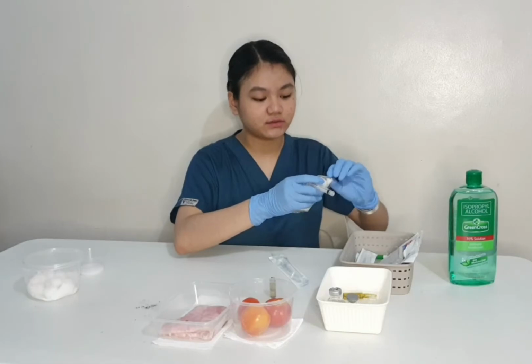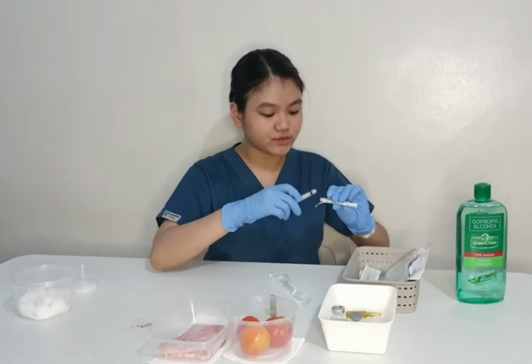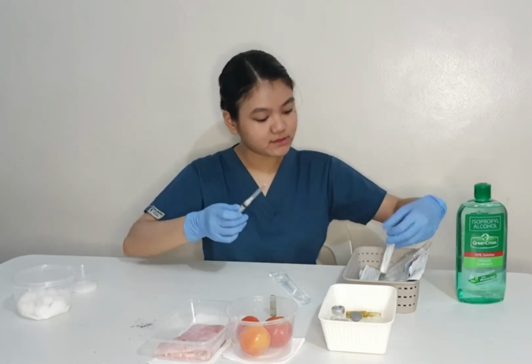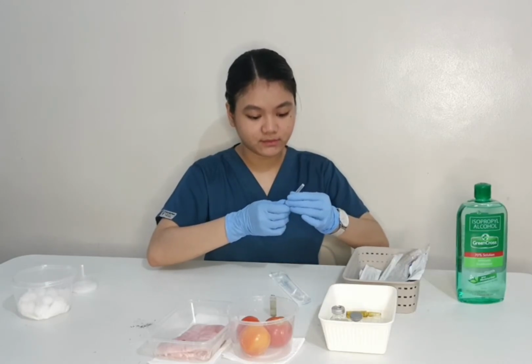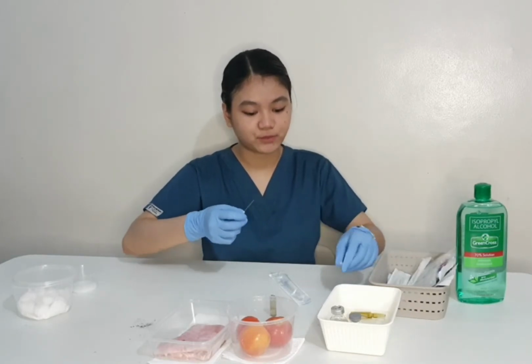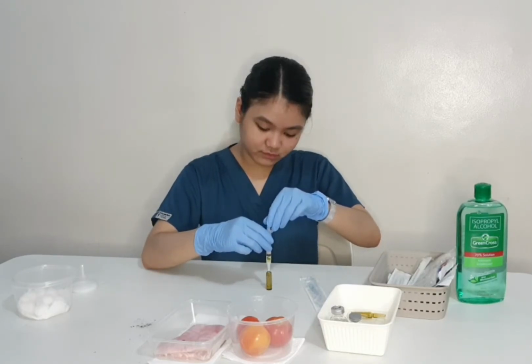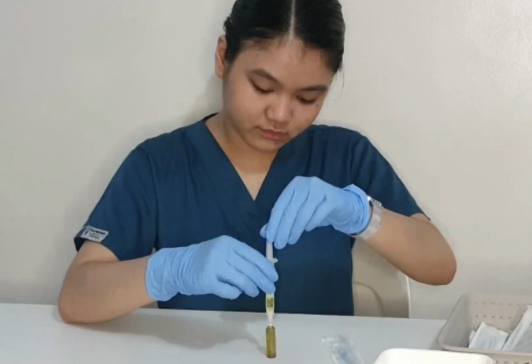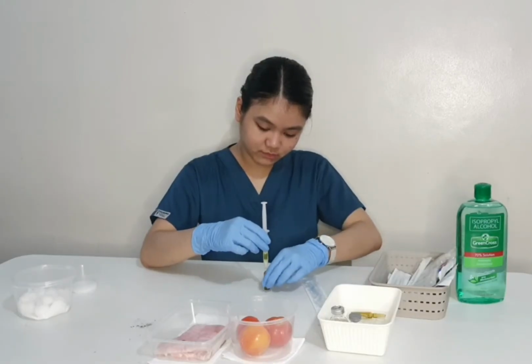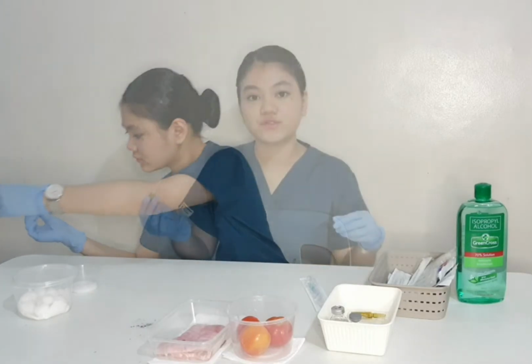Then get the 19 gauge needle. There you go, we can also change it here. Just twist it so that we can maintain the cleanliness of the needles. After that, we can remove the cover of the needle carefully so that we will not get a needle prick. We can now proceed to getting the ampule. There you go. Now let's throw the glass in the proper disposable trash bin.